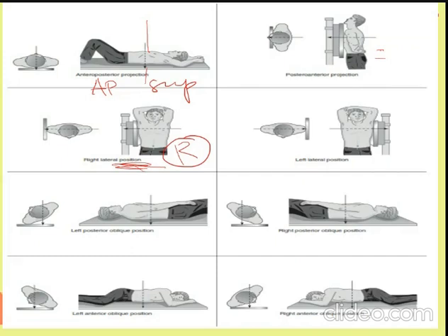Left, Doc. Left lateral projection. Very good. Right lateral position, left lateral projection. Okay, very good. So this one, the opposite.